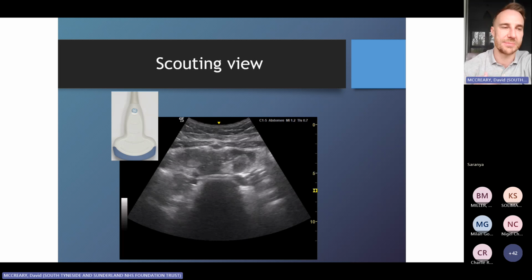I've had some unbelievable surprises in children who look really, really well. A 2-year-old who we recently transferred to the tertiary centre to be operated on was one of the wellest patients that I've probably ever scanned and had the worst perforation that I've ever seen. So this classical example of that crescendo pain, initial symptoms, and then possibly a bit of quiescence of that. So in her right lower quadrant on that scouting view, I was able to see absolutely grossly abnormal appearances. To use a kind of crude expression, it had looked as though a bomb had gone off down there.